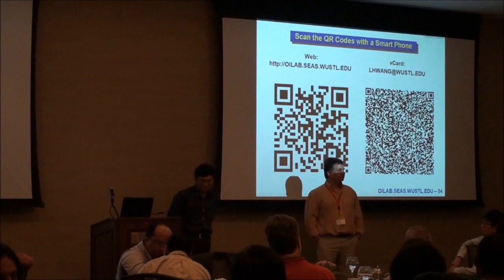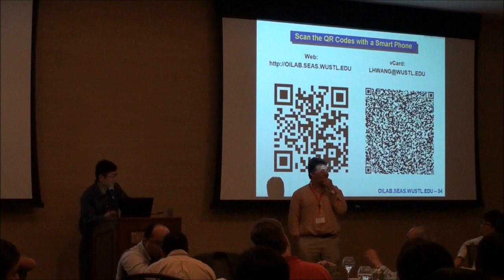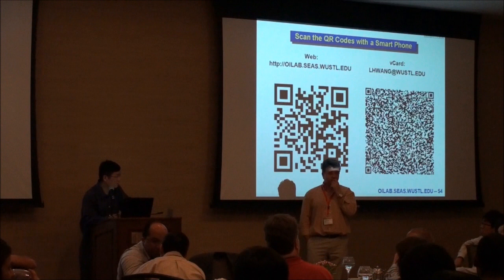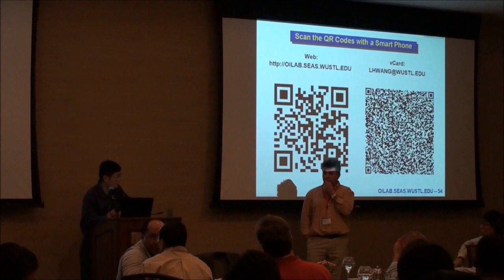Well, that study was for our neurologist. His goal is really to see the plaques inside the brain. So usually you have to use a contrast agent in order to label the plaques. Labeling the skull was really not his goal for that particular study. We just injected the contrast agent to see if we could label any of the blood vessels. It turned out we only labeled the skull because the dye doesn't get into the brain very fast.